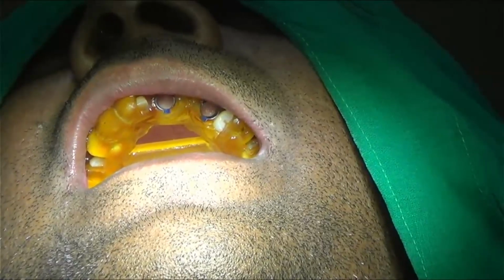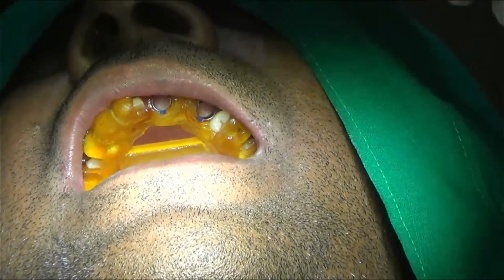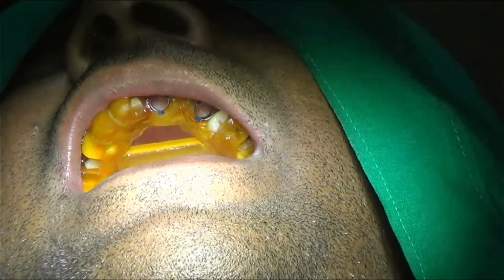My first drill is my tissue punch drill. So the first drill is my tissue punch drill.